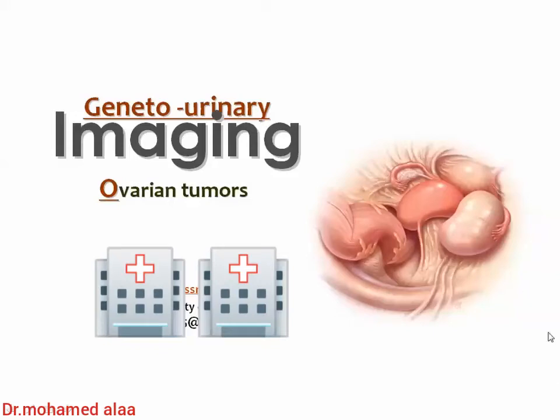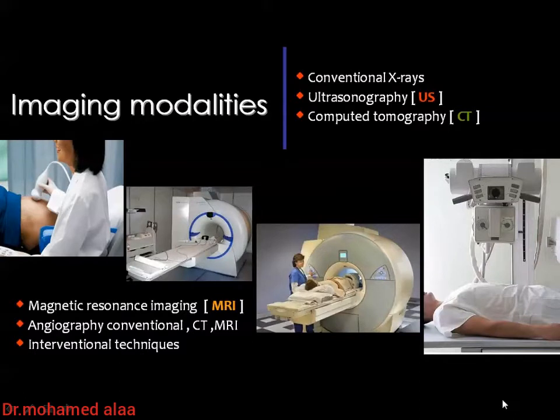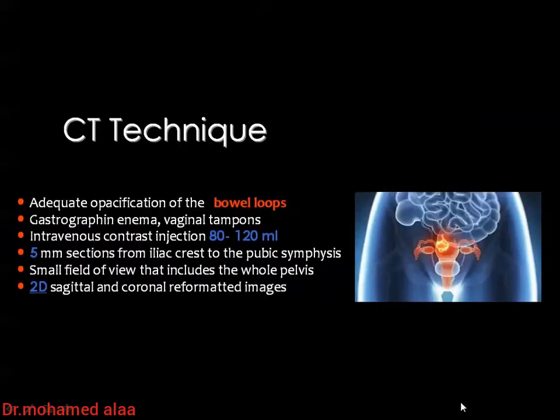masses. And you know that we have many imaging modalities to assess the pelvis, especially the ultrasound, the CT and MRI, and we may have the role of the plain X-ray to have some idea about what's going on in the pelvis, as I will show you.